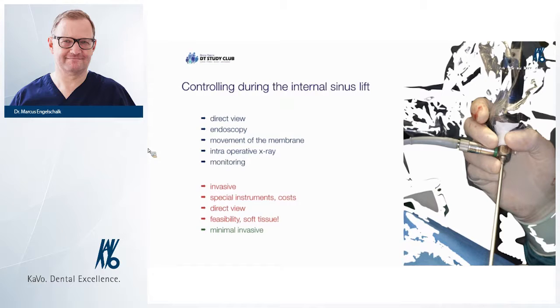After perforation of the residual crestal bone, the membrane will be elevated by the oscillating sterile saline, pushed up by the principle of Pascal, as I already mentioned. Now you're creating a space for the augmentation material. It's a tension-free elevated membrane because you won't use any instrument. You won't use a balloon with a peak of the pressure of the tension at its top. Well, it's a liquid, and it's very easy. And afterwards you can bring back the used amount of liquid of sterile saline solution.